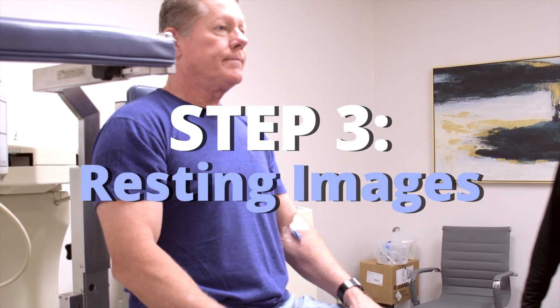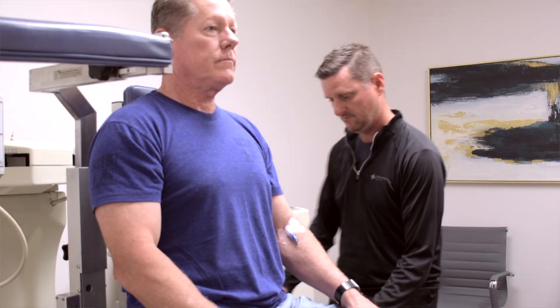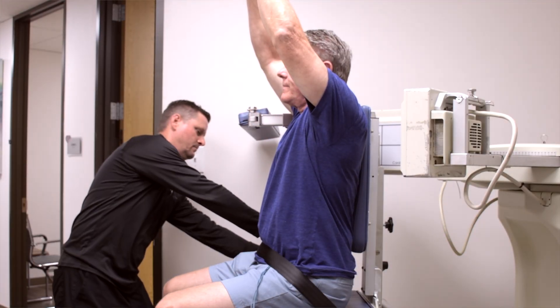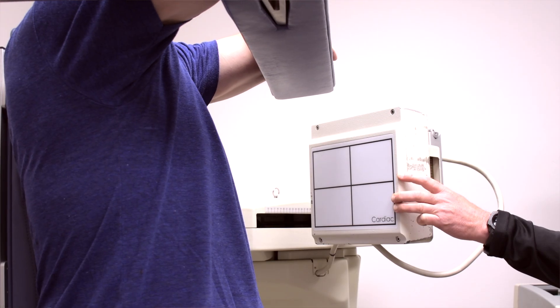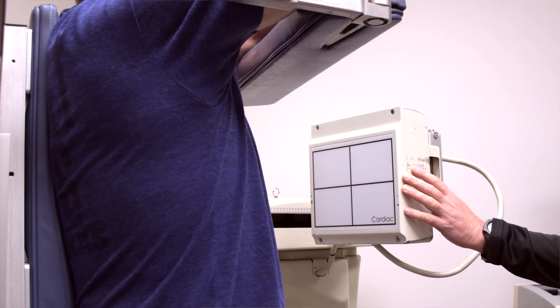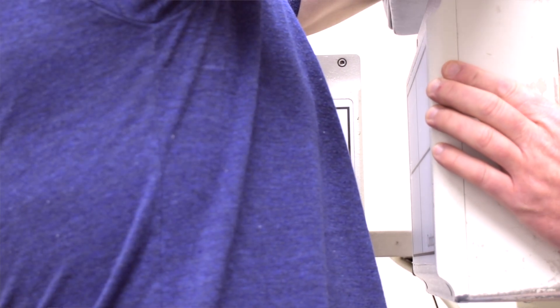Next, you will be taken to the imaging room where our machine will capture resting images of your heart and your heart function. This is done while you're sitting in an upright position, which makes the experience much more comfortable for you and produces higher quality images than if you were laying down. Because you're sitting upright, the camera can be placed closer to the heart, which helps reduce imaging time and produces a much more accurate image. The whole process takes about eight to nine minutes.